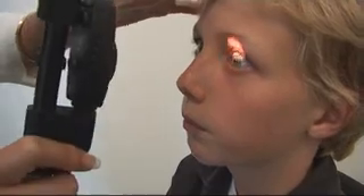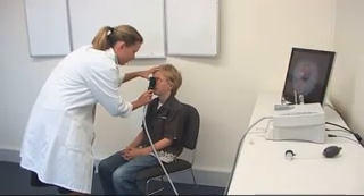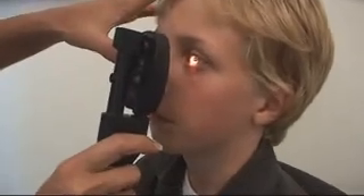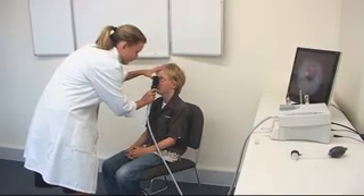The ophthalmoscope probe is designed to provide brilliant images of the retina for both large and small pupils. It has a choice of 5 apertures and 28 lenses from minus 35 to plus 20D. Select fixation star or cobalt blue filters for corneal examination. No additional light sources are required as the illumination is supplied through the handpiece. The probe is designed for use with dilated pupils.